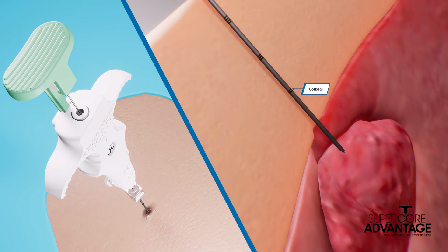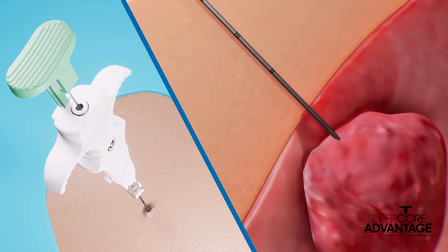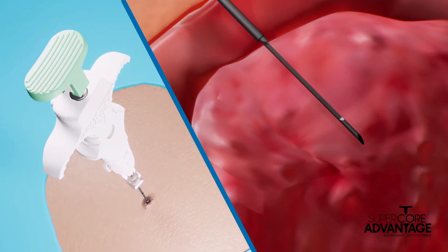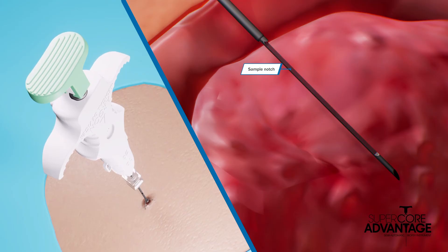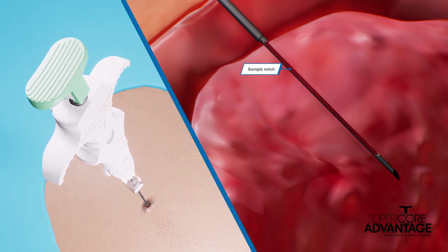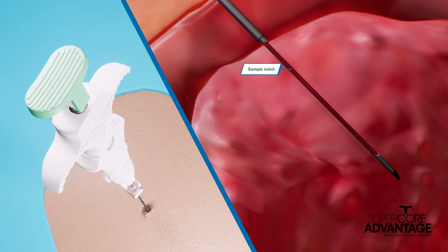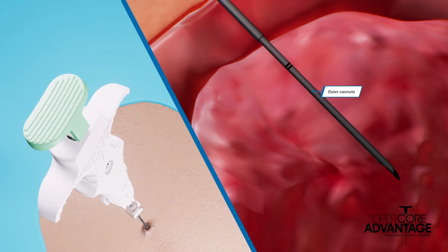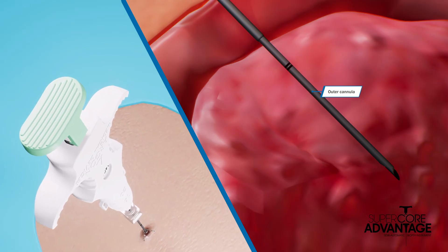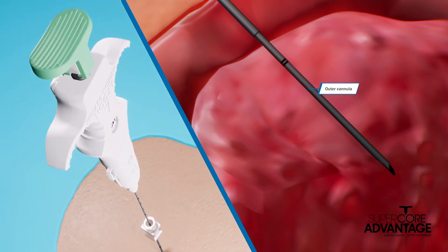The stylet is positioned proximal to the lesion. To advance the stylet, press the rear plunger forward. The SuperCore Advantage coring cannula advances forward, allowing the tissue to prolapse into the sample notch. After the sample notch is in the desired location, press the rear plunger to deploy the outer cannula to encapsulate the specimen. The instrument is now removed from the patient.